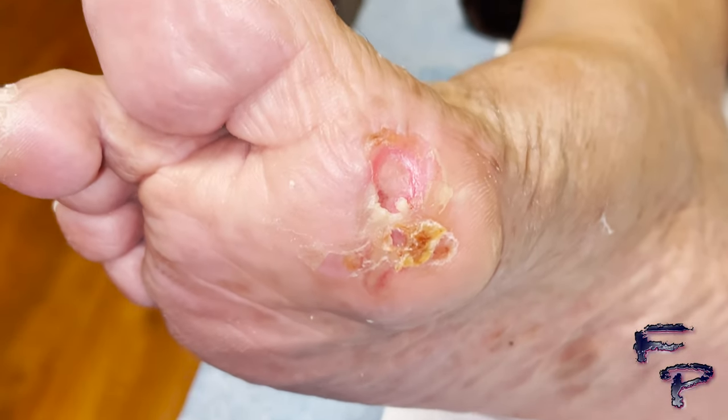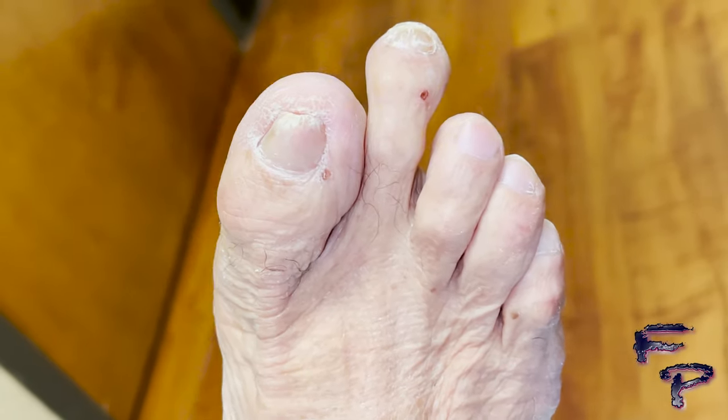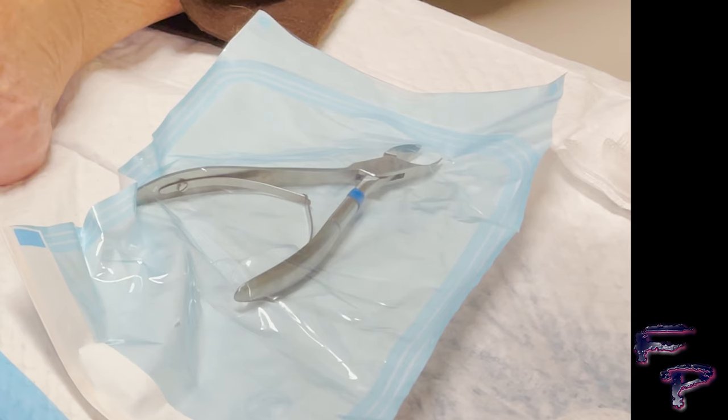This is a Wagner grade 2 type ulcer on the bottom of the foot. As you can see, there is no redness, no erythema, no signs of infection.